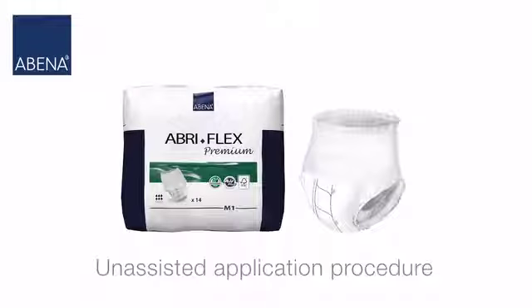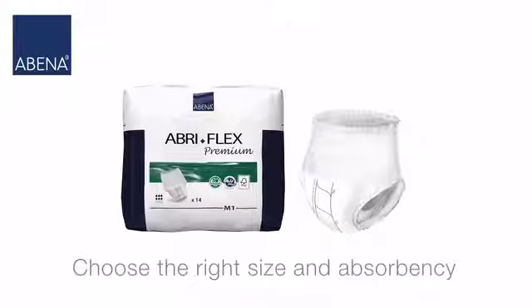This video describes the unassisted application procedure for an AbriFlex Premium. Make sure that you choose the right size and that the absorbency is suitable for your incontinence level.